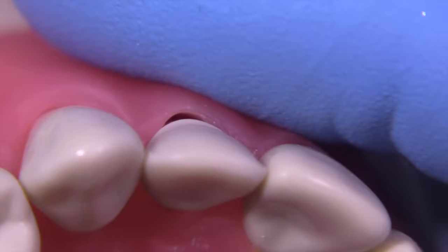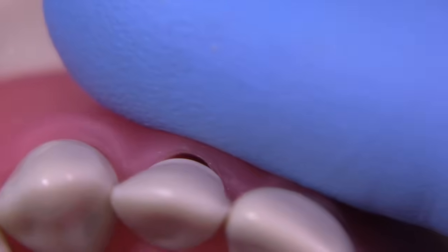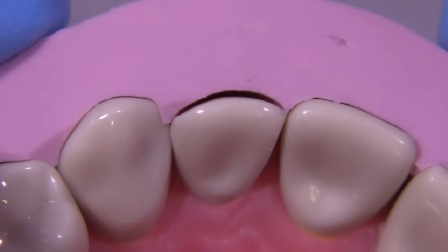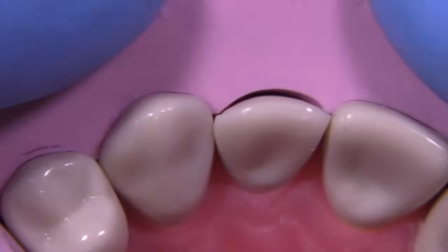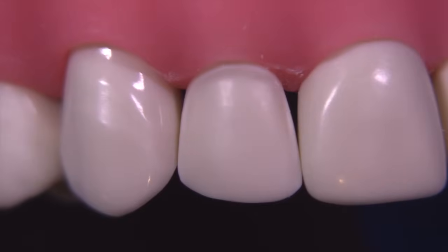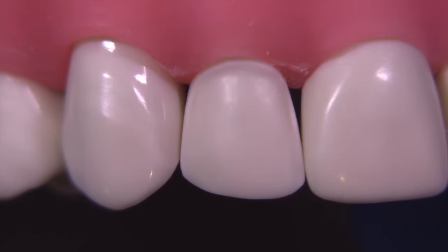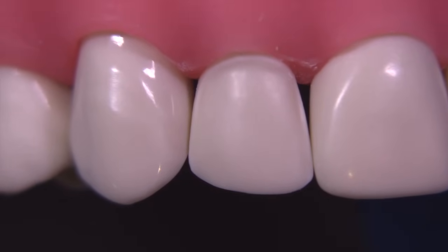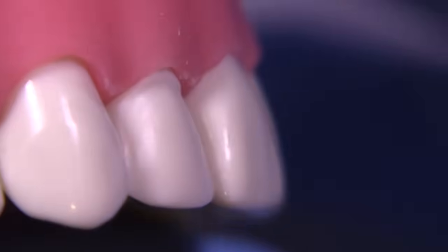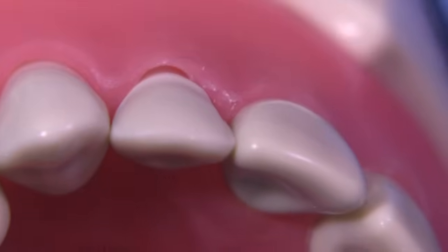So now I think the preparation is essentially done. Let's go ahead and check it with the prep guide to make sure that we're okay. We have adequate reduction. We'll start by looking at it from the occlusal third. We see it's fairly uniform, then the middle third, and then we're going to look at it from the gingival third. So we're pretty satisfied with the prep, and it would be adequate now for taking a final impression and performing the provisional. We are going to talk about provisionals in part 6 of the series, and I'm going to teach you at least 2 ways, if not 3 ways, to make veneer provisionals.